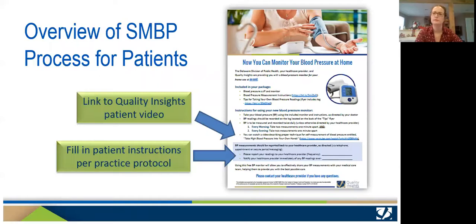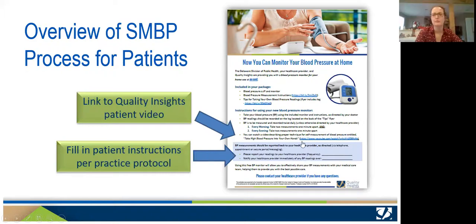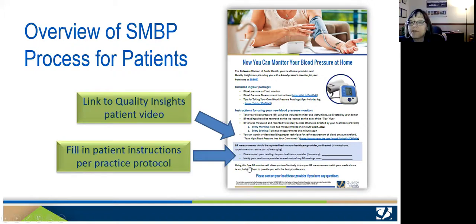Okay. Great. So one other thing I want to point out to you is over here where I've written down when Dr. Smith wants you to bring back your blood pressure readings and how he wants you to report them. So he wants you to bring back the paper log when you come back in a month. So that's written down here in case you forget. And also I want to point this out here that says to call us or to seek medical attention if you get a reading that's outside of a certain range. So if it were to be low under this reading here or high, and you were to confirm that, then we would want you to call us.